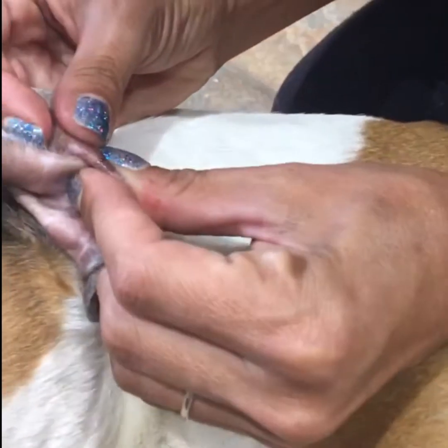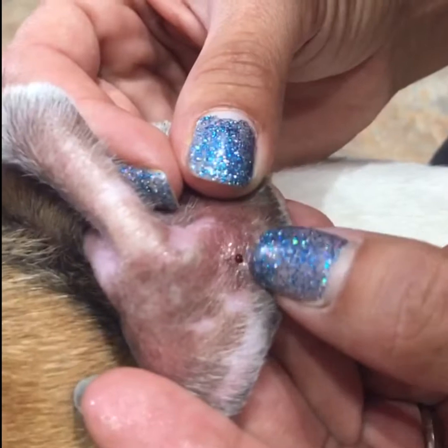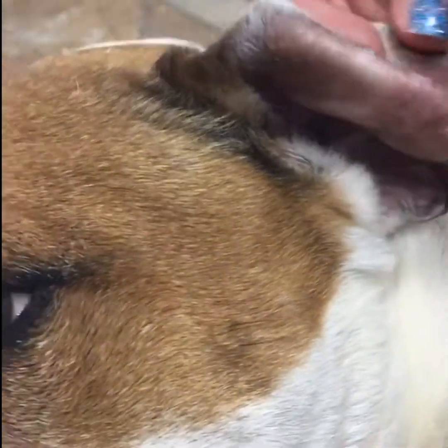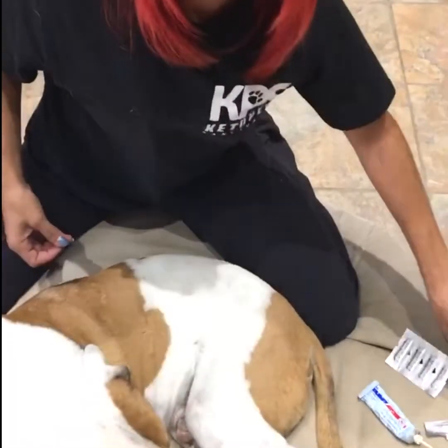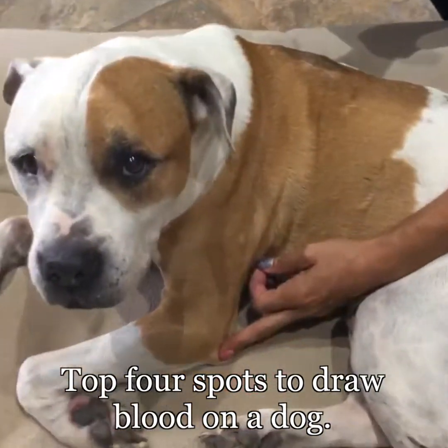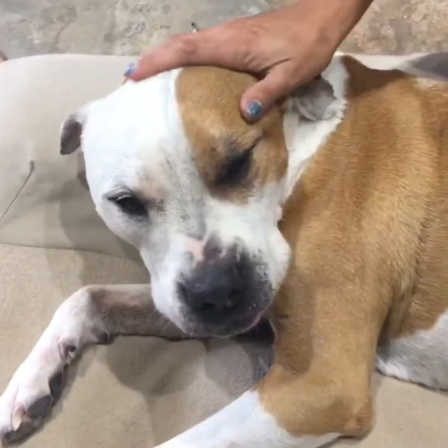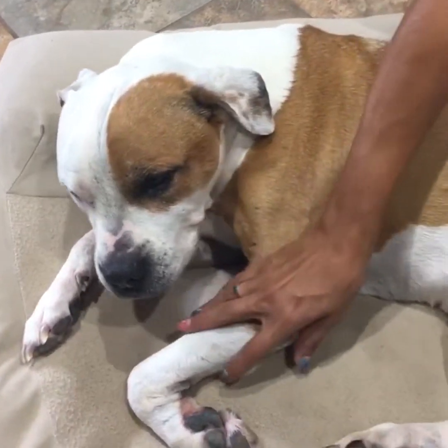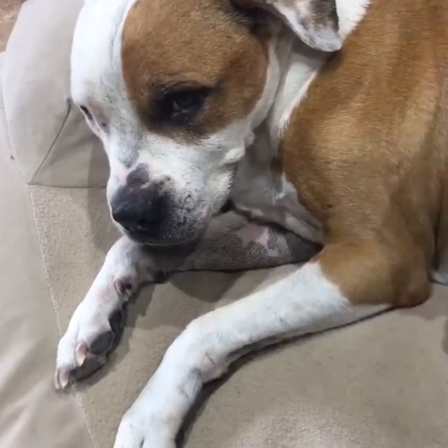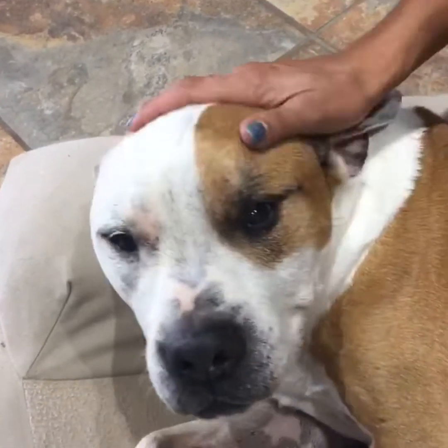As you can see, it's not soaking into his hair — it just kind of pools on top instead. It doesn't bleed as much as a normal stick, so I'm not a big fan, especially when you need a lot of blood for both tests. My favorite spot is the elbow callus — it bleeds more and they're less affected. Number two is the inside of the lip — bleeds pretty well and doesn't seem to bother them much. Next would be the paw pad, though those are pretty sensitive. Last resort is the ear.